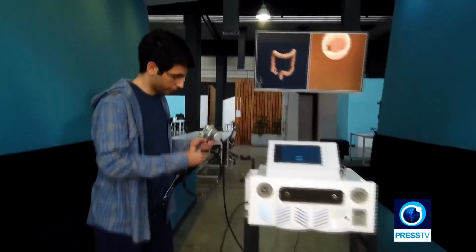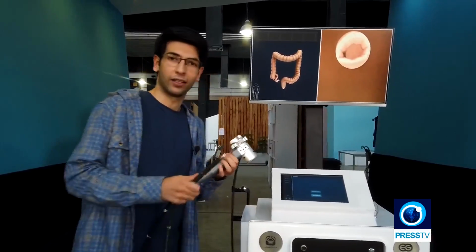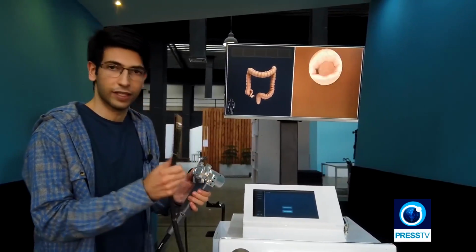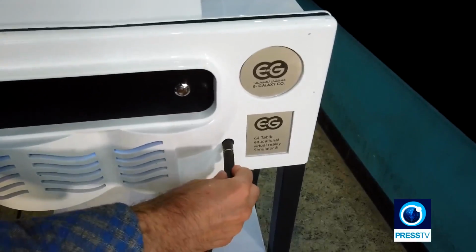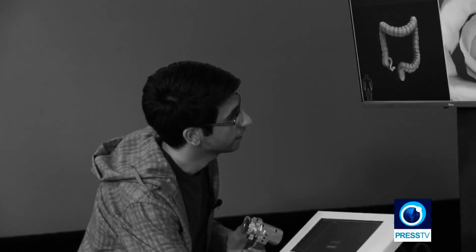So I'm going to take out this endoscope, which is the tool that they use to diagnose problems in the colon, using this handle, which is the only aluminum handle that exists in the world, and these gears to basically give the orientation of this endoscope when you're moving inside the colon. So I'm just going to insert it into the simulator and see it move inside the colon.